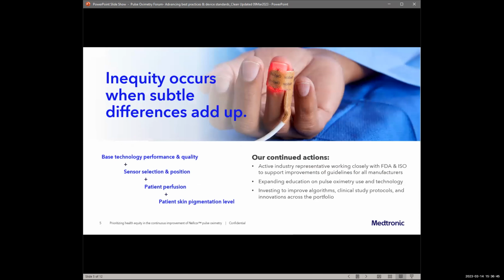So inequity occurs when subtle differences add up. I think this is something we've been talking about all day today. And these are all the factors that affect measurements and the ability to estimate oxygen saturation using the pulse oximeter. So rebuilding the confidence in the technology and the clinical use, which provided such clinical benefit over the years, is our position here today. The perception issue from the recent review of real-world clinical use cases, in both technology development as well as the education that can be provided right now, is critical to advancing equitable healthcare.